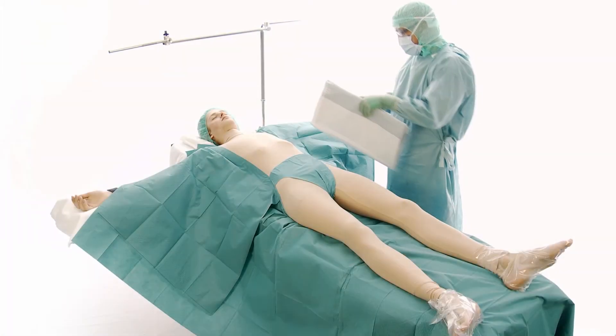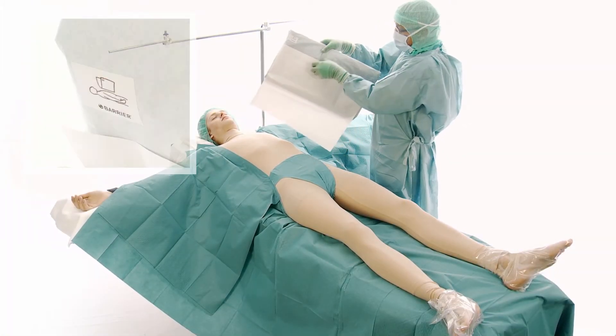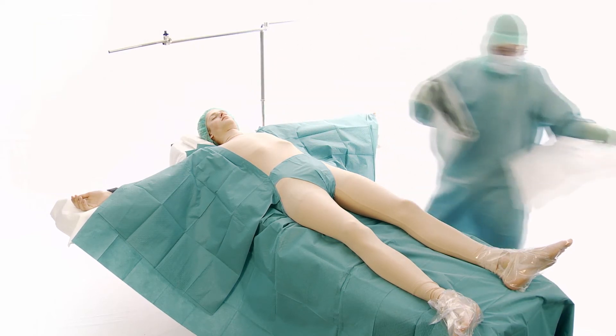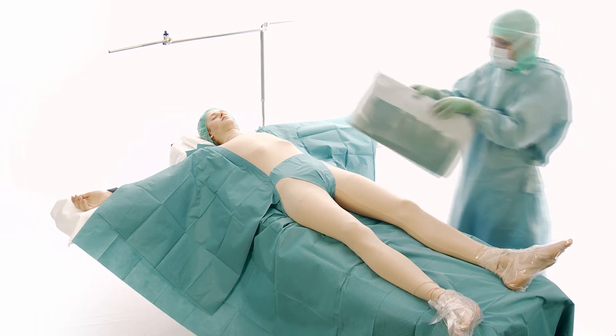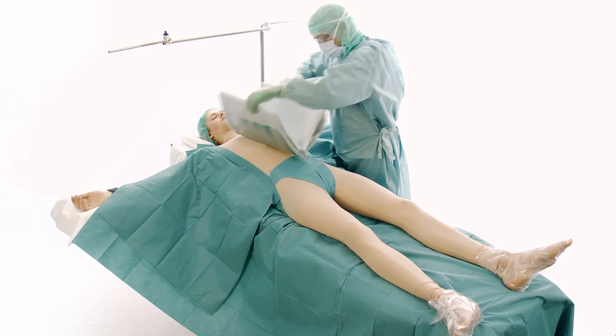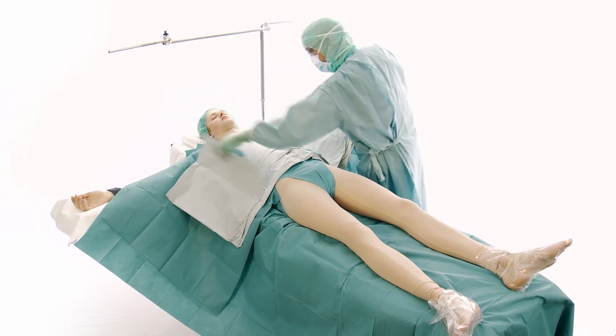Note the direction of the pictogram on the thoracic drape. Remove the release paper and place the drape centered on the patient. The upper edge of the incise film should be at the suprasternal notch. Ensure that the adhesive film is securely attached to the patient and unfold the drape.